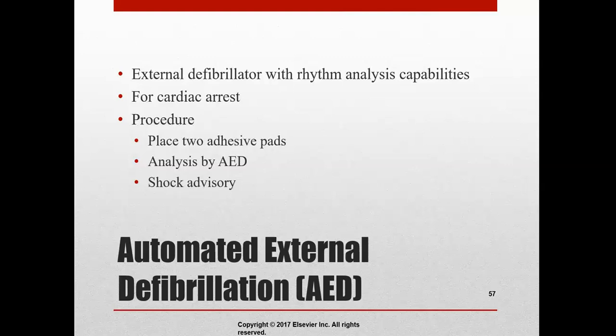So we use them to defibrillate and to analyze rhythms. We use them for cardiac arrest, and the procedure is to place 2 adhesive pads. You analyze with the AED, it looks at the rhythm, and then it gives a shock advisory. It tells you shock is needed or shock is not needed.